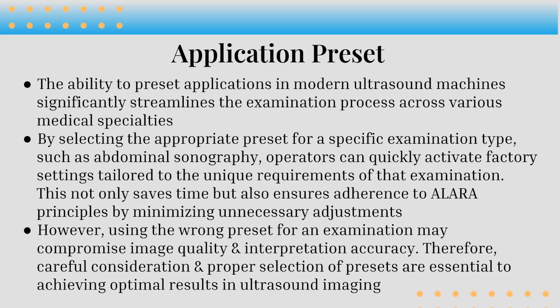This not only saves time, but also ensures adherence to ALARA, which means as low as reasonably achievable. It is an ultrasound physics term that everybody that performs ultrasound should abide by. It minimizes unnecessary adjustments. However, using the wrong preset for an examination may compromise image quality and interpretation accuracy. Therefore, careful consideration and proper selection of presets are essential to achieving optimal results in ultrasound imaging.